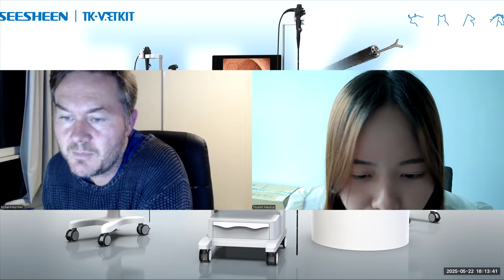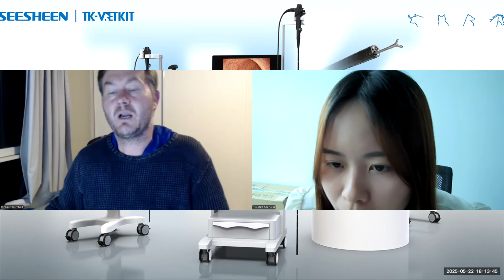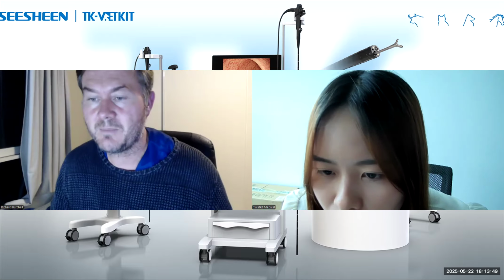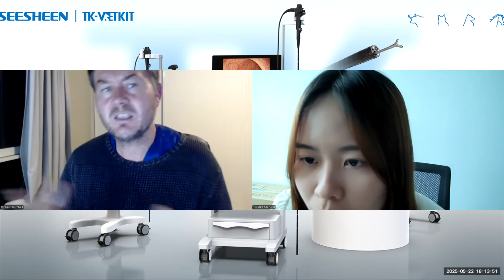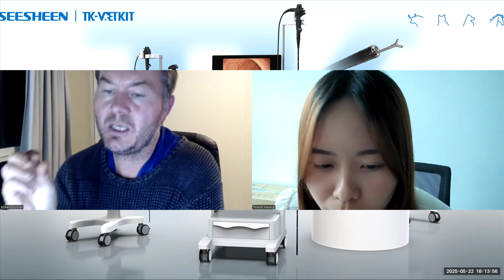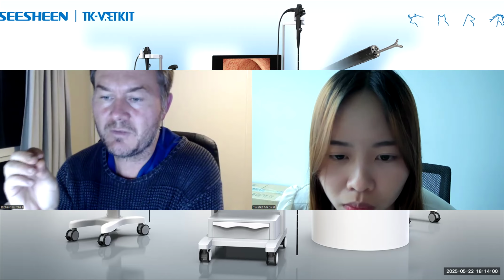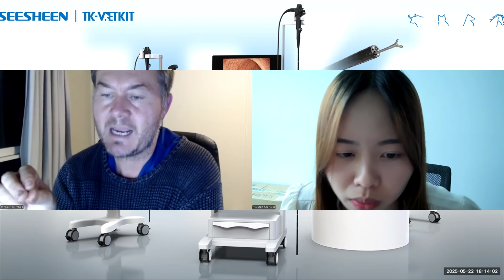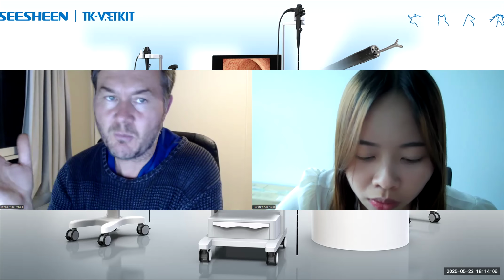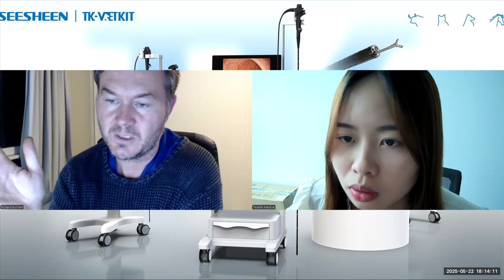So, is oxygen necessary to see lungs in large animals? I haven't done that, so it's not really my area of expertise. I think the principle is pretty similar. It's simple: how much of the tracheal lumen is your scope occupying? If there's enough space around your scope that the animal can breathe past it, and you're monitoring its clinical status, then I don't think you have to have oxygen.